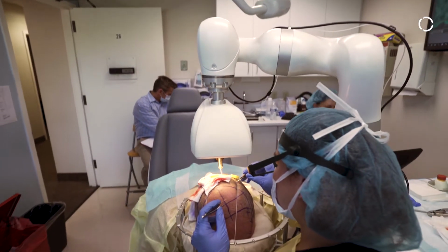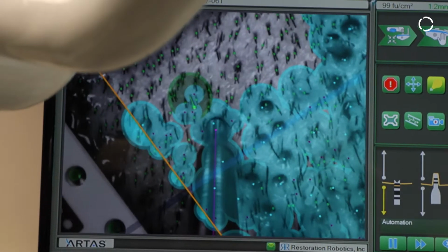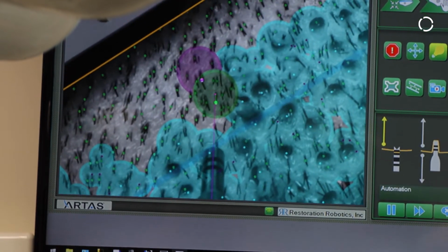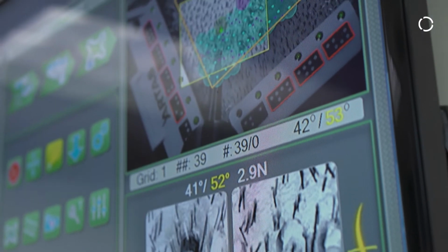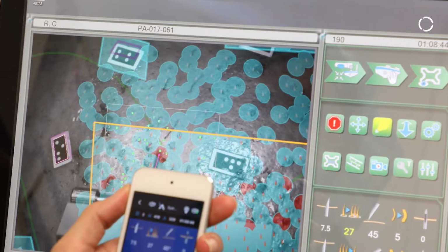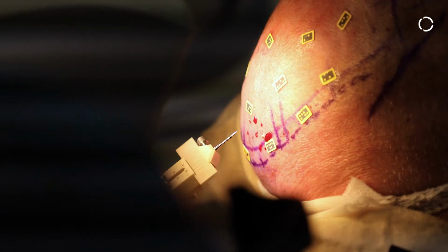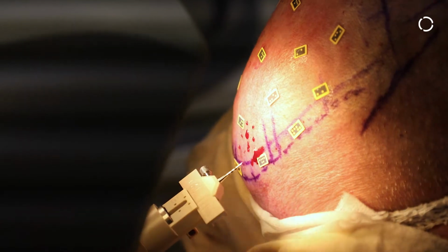The idea is to give a natural appearance more than anything else. And the robotic procedure really allows us to do that by its algorithms that allow natural spacing from the back so that it's not over-harvested, by allowing us to miss native hair so we don't traumatize existing hair and cause shock loss, to allow us to program a density that is such that it looks real but without spottiness here and too much density there. So it really allows a better distribution of the grafts and prevents trauma at the same time. Some of the things that you have a hard time doing if you're trying to do it by hand.